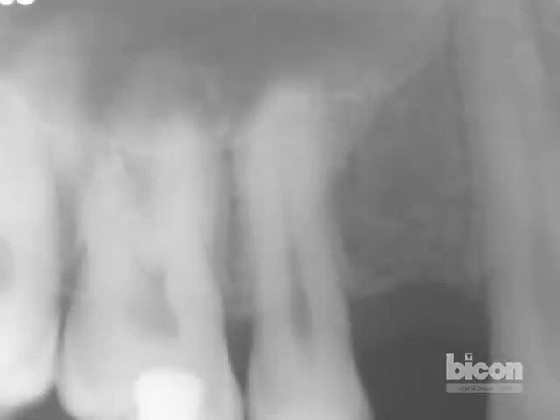The space is quite adequate for a BICON short implant, with a height of slightly over 10 millimeters between the crest of the bone and the floor of the maxillary sinus. Mesiodistally at the narrowest, which is right at the crest of the bone, we do have a little over 7.5 millimeters.